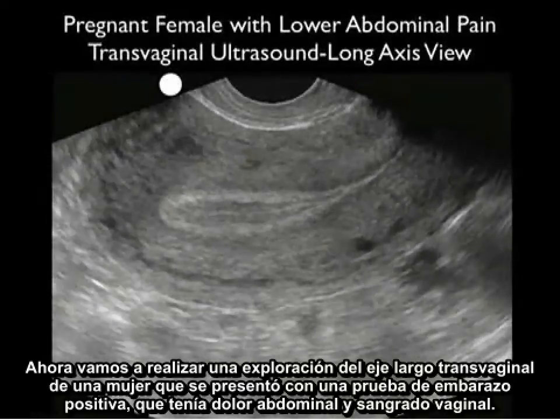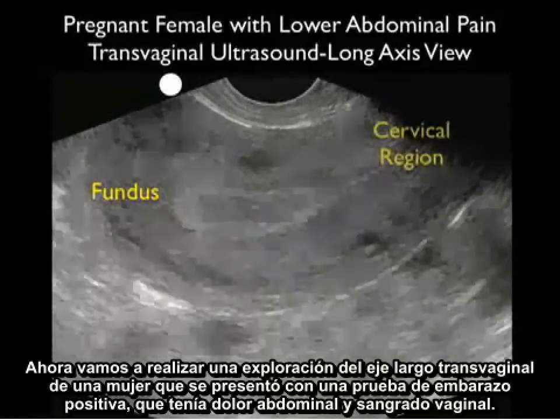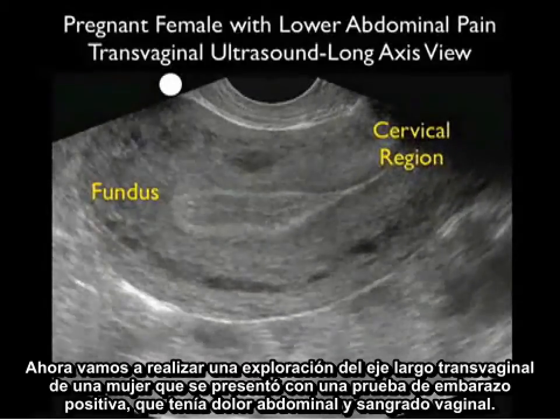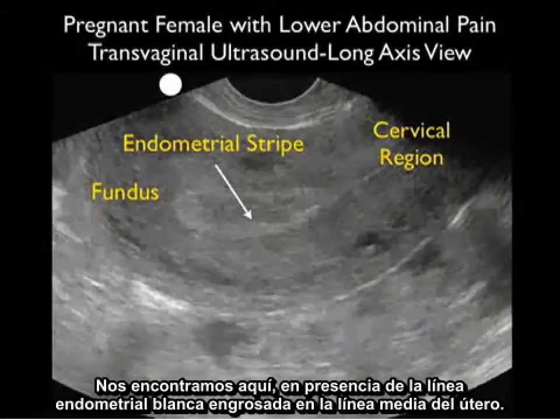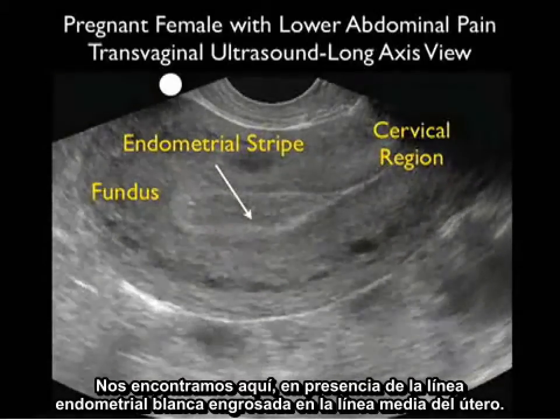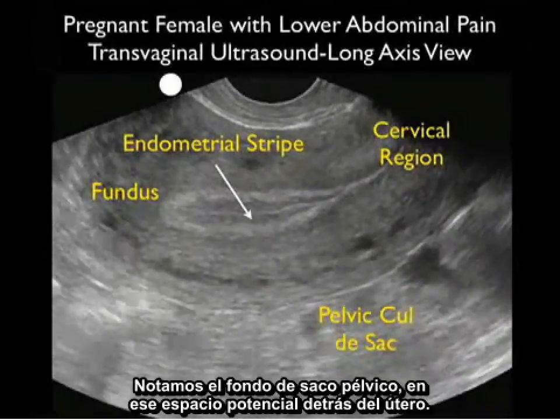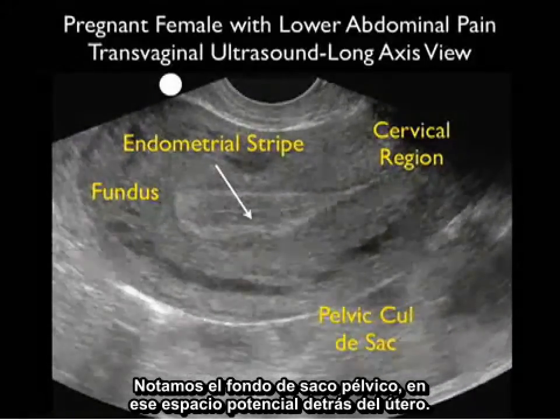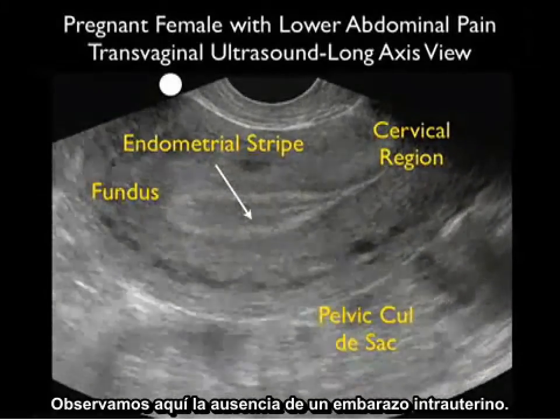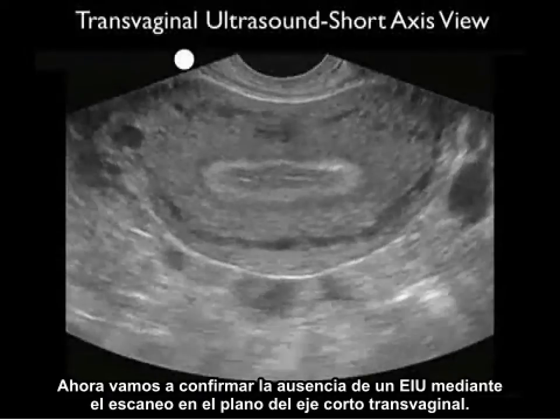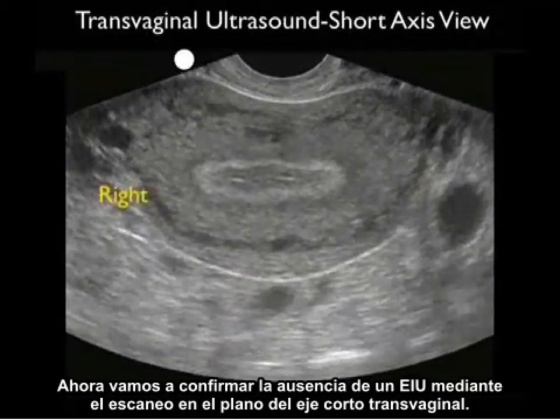Now let's review a transvaginal long axis scan from a woman who presented with a positive pregnancy test, lower abdominal pain, and vaginal bleeding. Notice the fundus shown here to the left and the cervix to the right. We see the presence of a thickened white endometrial stripe in the midline of the uterus. Notice the pelvic cul-de-sac — that potential space posterior to the uterus. Notice the absence of an intrauterine pregnancy. We'll confirm the absence of an IUP by scanning in the transvaginal short axis plane.